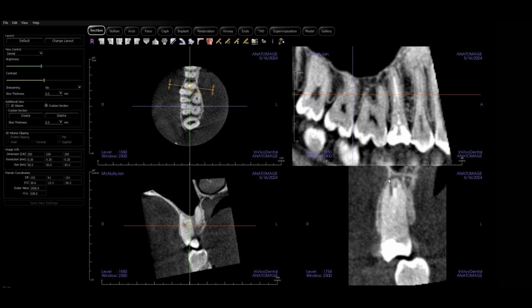You put one file in to length, and then you try to place a second file to length. If that second file doesn't go to length, odds are you're binding on the first file. You then lift that first file, and if the second file goes to length, you then know that the two files can't coexist at the apex together. So what that means is that this diameter here is actually not wide enough, or they meet together and it's actually one portal of exit. We call that a 2-1 situation or a 1-2-1 situation. I think you and I have talked about that before, so I don't think that's surprising.